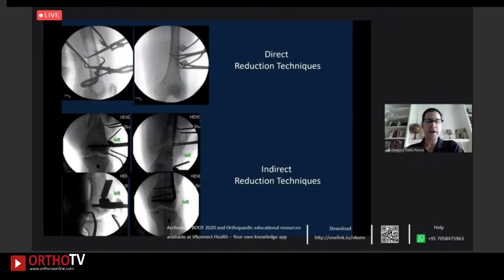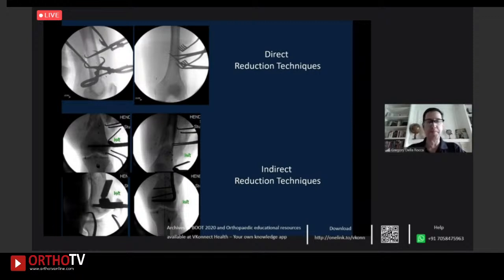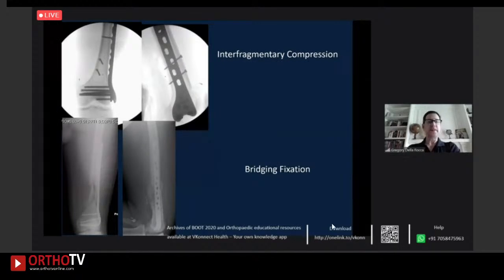You can see absolute stability with a neutralization plate and lag screws for the simple fracture, and a bridge plating construct for the comminuted one.